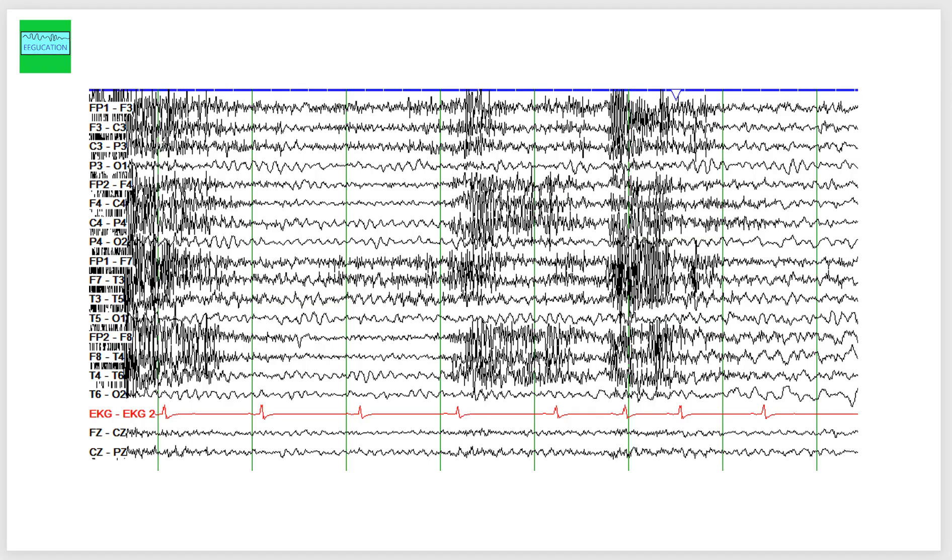So let's start here. The channels that end with the odd number are recording from the left side of the brain. Channels that end with the even number are recording from the right side of the brain. And channels that end with the letter Z are recording from the midline.